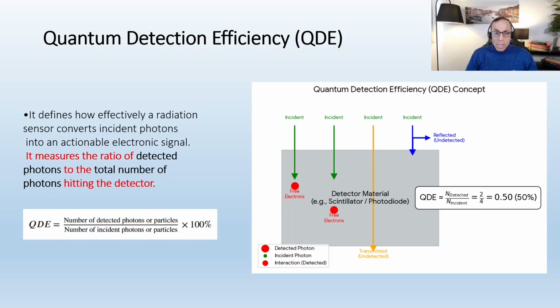Conversely, a CBCT flat panel requires a thin scintillator layer to keep the light from spreading laterally and blurring the image. So, the thin layer sacrifices photon absorption, dropping the QDE down to around 40 to 60%.